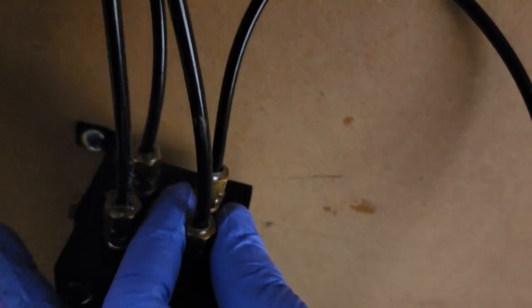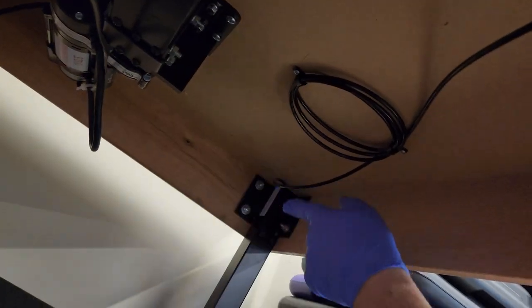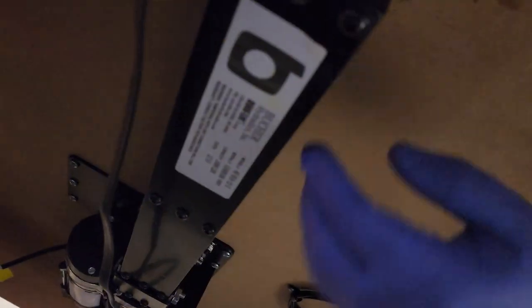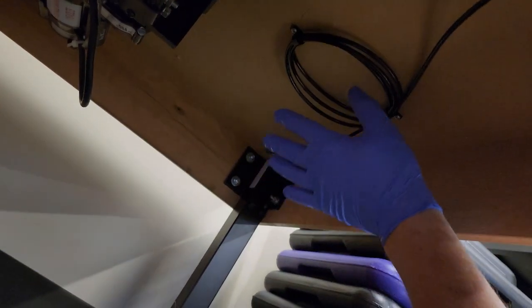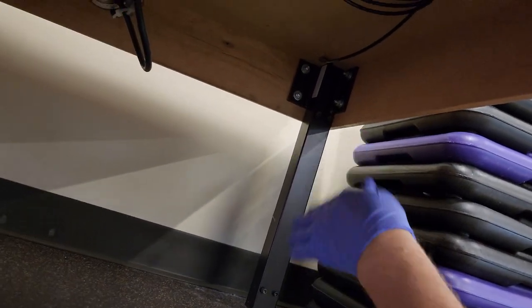Okay, so hydraulics, just to let you guys know, to be safe, what we were going to do is lower it all the way down, because when you take this off, there's no check valve or anything. So fluid is going to go everywhere, all over me. It's going to be fantastic. But it's also a safety precaution, because when hydraulics no longer have their control mechanism, the fluid just freely escapes the cylinder, especially since it's under load. It's weighted. Since it's under load, it could be very dangerous. So lower it all the way down. Same thing with surgical tables. We lower it all the way down.